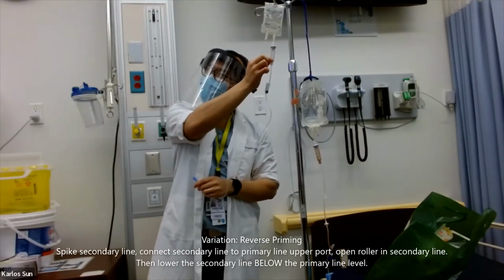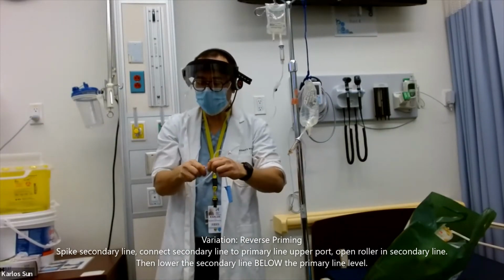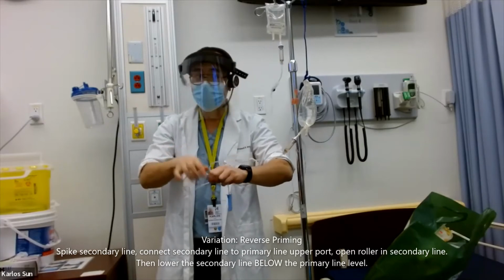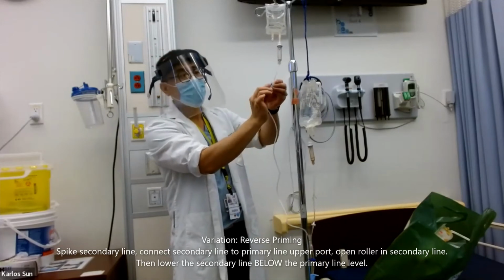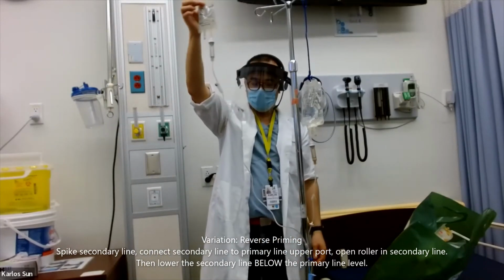Now I'm going to show you another method to prime your secondary line called reverse priming. In this method, you spike the secondary line, connect the secondary line to the primary line upper port, open the roller in the secondary line. Now note that in this method, we did not squeeze the chamber halfway.